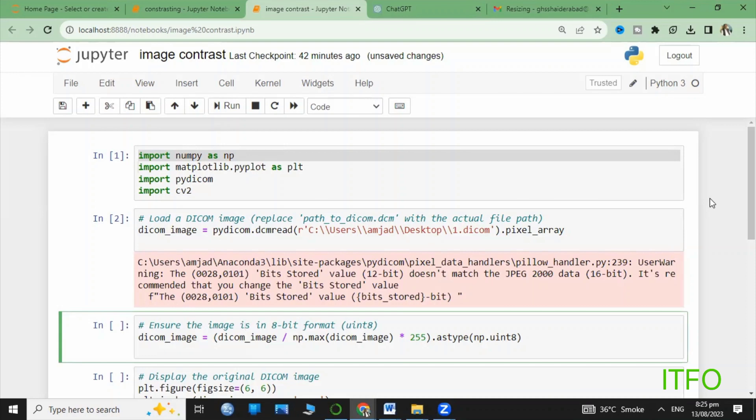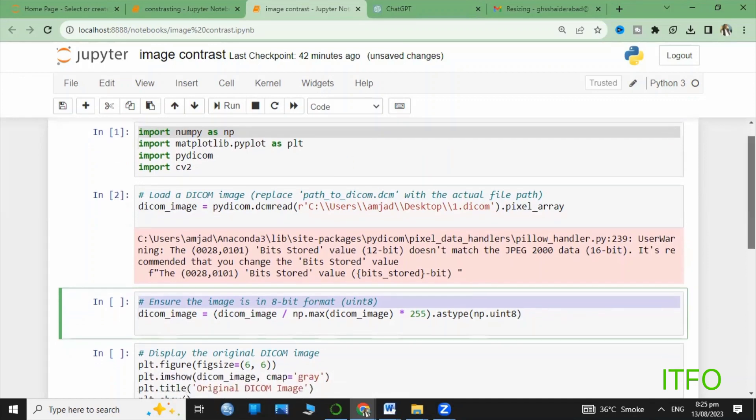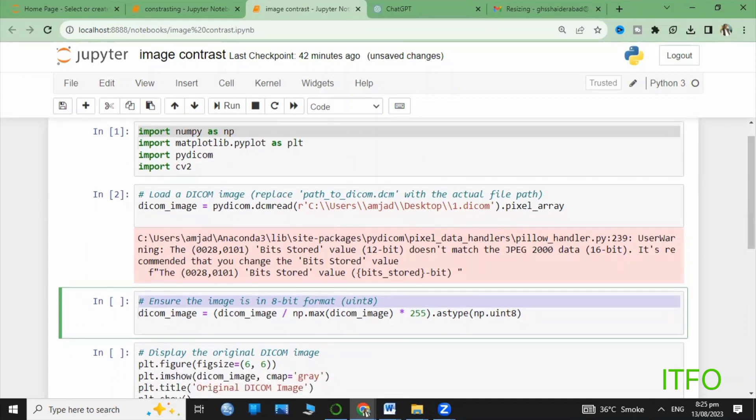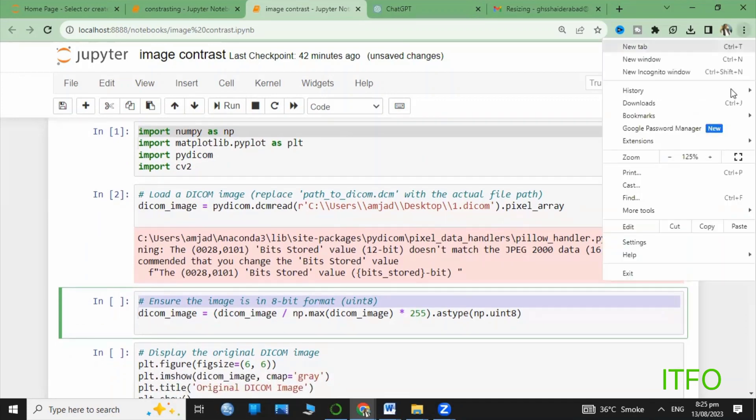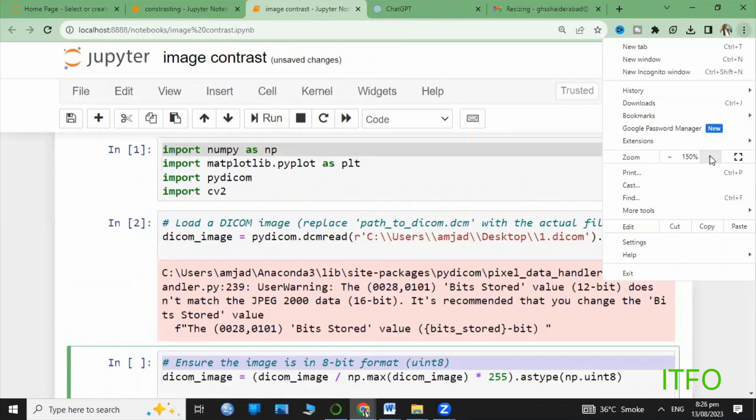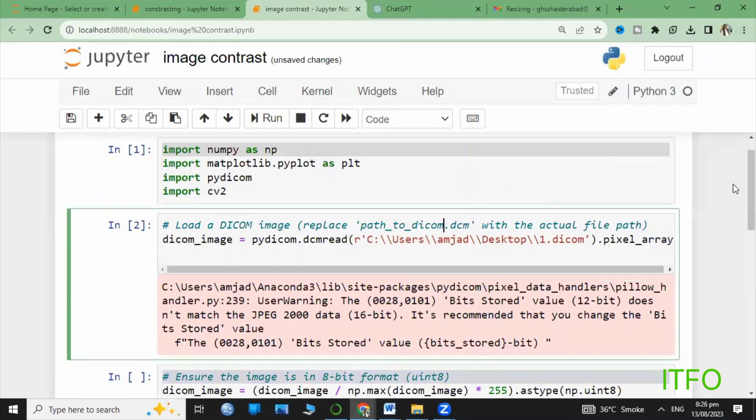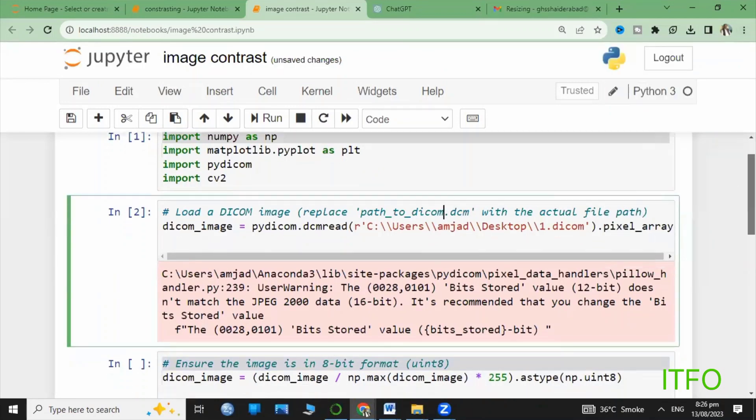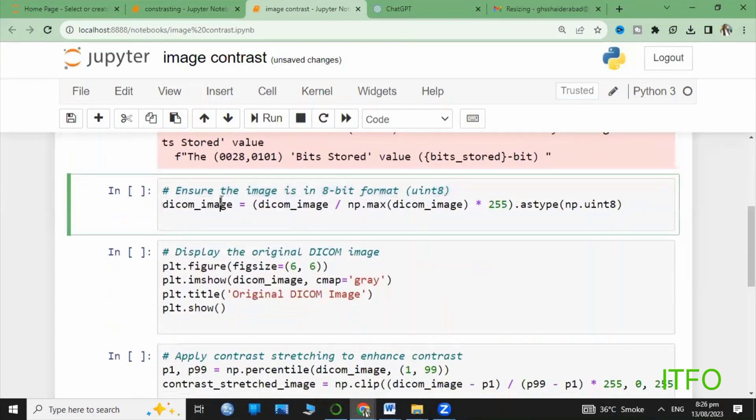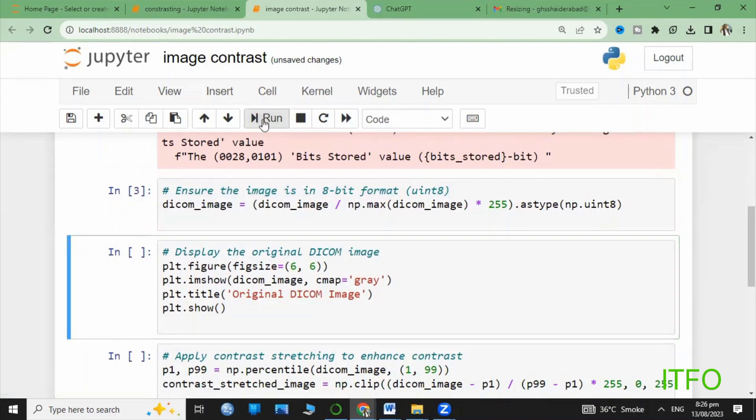Here's the load DICOM image code. We use the DCM read code and here you use your image path. For display, we first display the original image before applying the contrast or any operation. Here you can observe the original image.